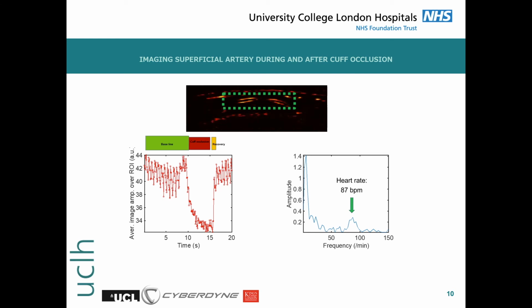Interestingly, Fourier analysis of the amplitude time curve can generate the heart rate. Non-invasive measurement of blood flow could be very useful in assessment of a number of other useful parameters, such as cardiac output, stroke volume, cardiac contractility, left ventricular ejection time, and total peripheral resistance, all of which can be derived from measures of peripheral blood flow.